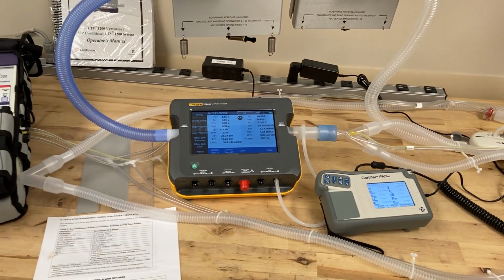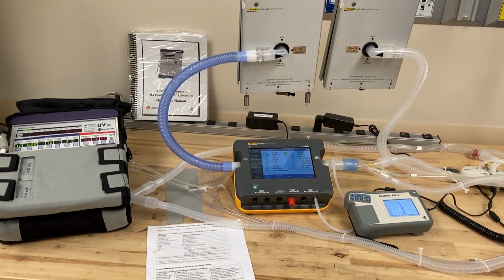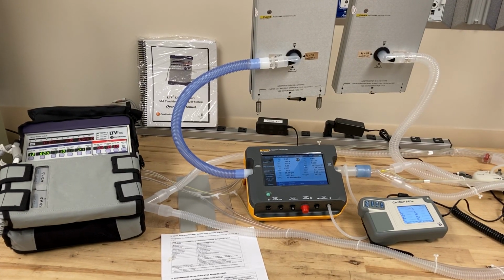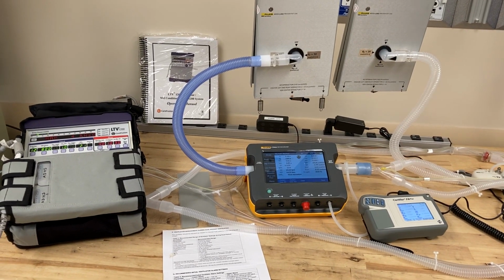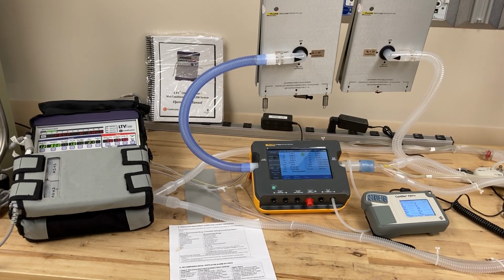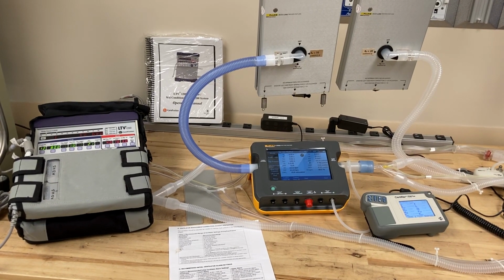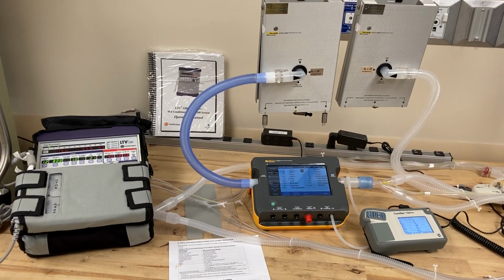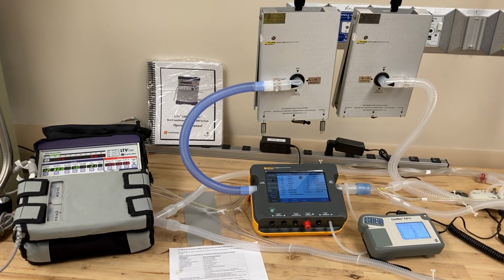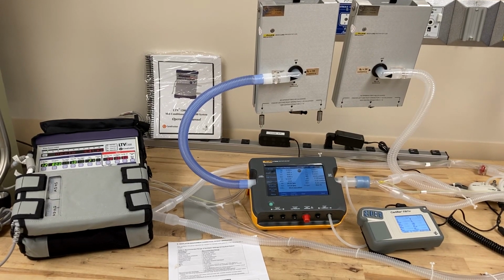So what we have proven today is that indeed, with different compliances on the test lungs, as long as you use control volume mode, it looks as though you could, if you had to, ventilate two patients at the same time with different compliances and deliver good volumes.